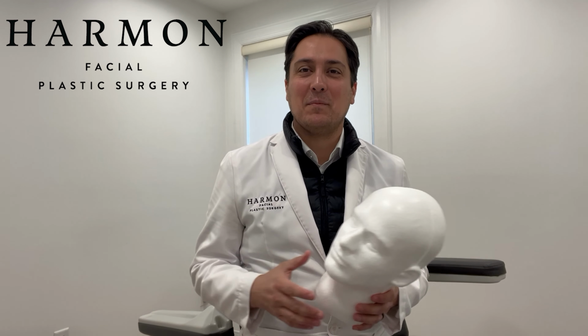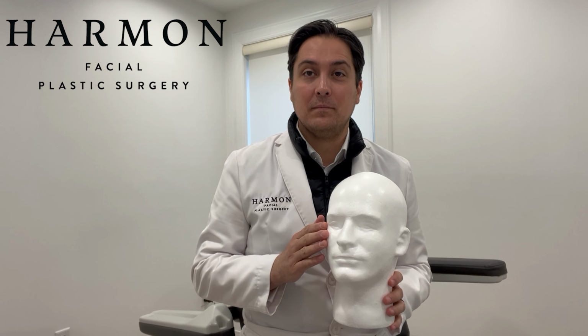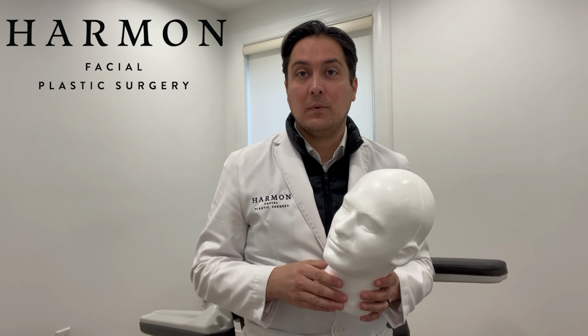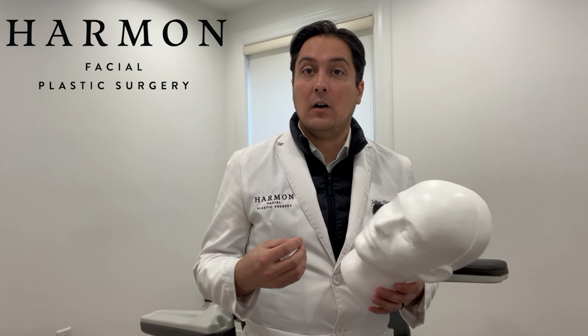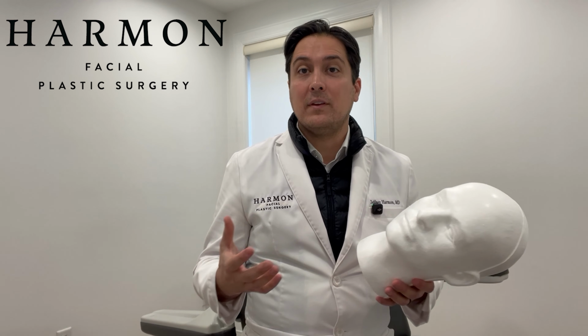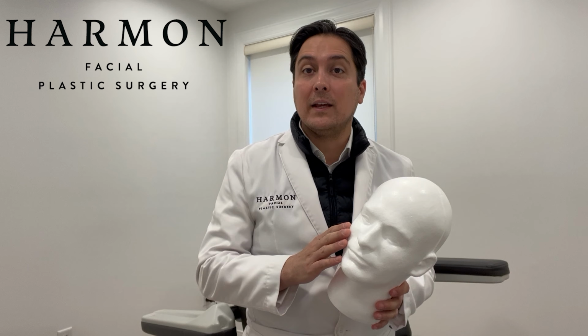Everyone, today I'd like to talk about filler, specifically filler placement in the cheeks, and I'm going to use this mannequin to help me out. So why do we place filler in the cheeks? Well, it's in order to add volume to areas that have lost or lack volume, and everyone's different. Some individuals are born with less volume in their cheeks, others lose it as they get older.